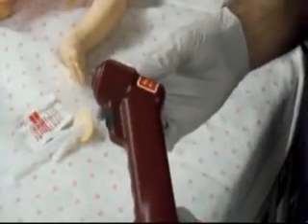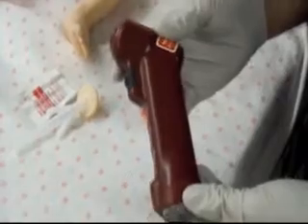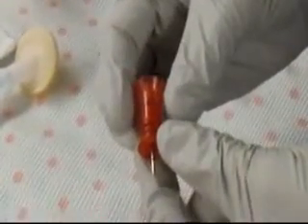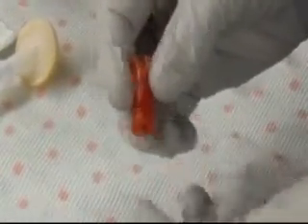This is the EZ-IO driver, which is similar to a drill that you would find in your garage. This small pink needle is a pediatric intraosseous needle. It's a 15 gauge needle, 15 millimeters in length, and is used on patients that weigh over 3 kilograms or less than 39 kilograms.